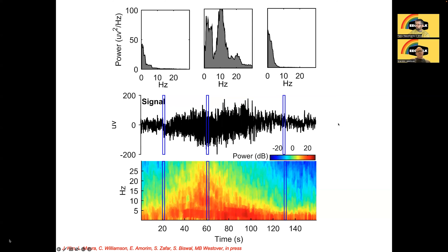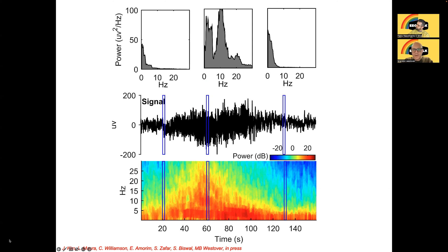Now we're going to move from spectra to spectrograms — that's why we have rainbows in here today, because we usually use rainbow colors for spectrograms. Let's look at the middle signal first: it's more than 140 seconds long. You can't appreciate it well because it's so squished, but there's a seizure happening in there. This is why we don't usually look at EEG data at this scale — we usually look at 10 or 15 seconds at a time.